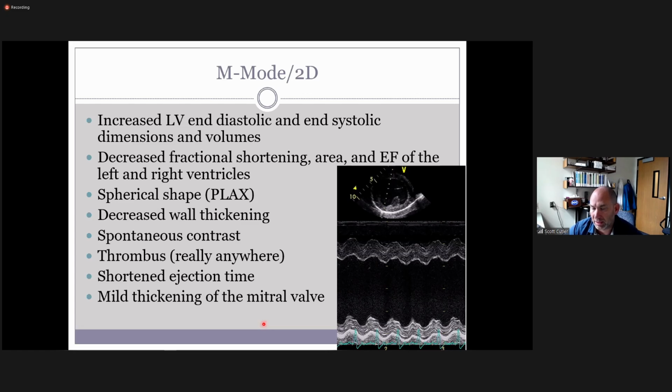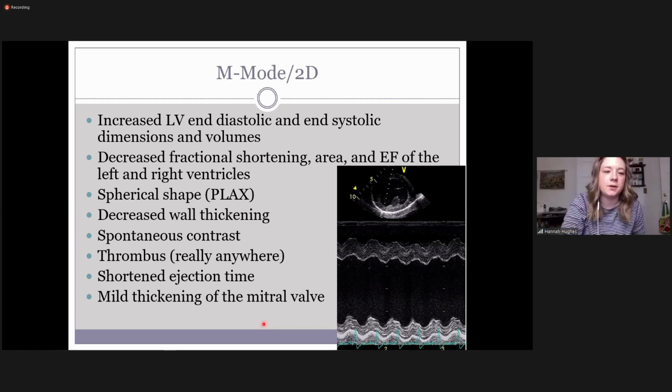So if you're seeing that slow flow, you should be looking for blood clots. Especially if you have a decreased ejection fraction, there's a good chance that you might have some. But yeah, it's kind of a precursor to that, because what's happening is the blood cells are starting to stick to each other at that point, and we're seeing bigger reflective surfaces. Does that answer your question, Hannah? Good. Yes, thank you. Okay.